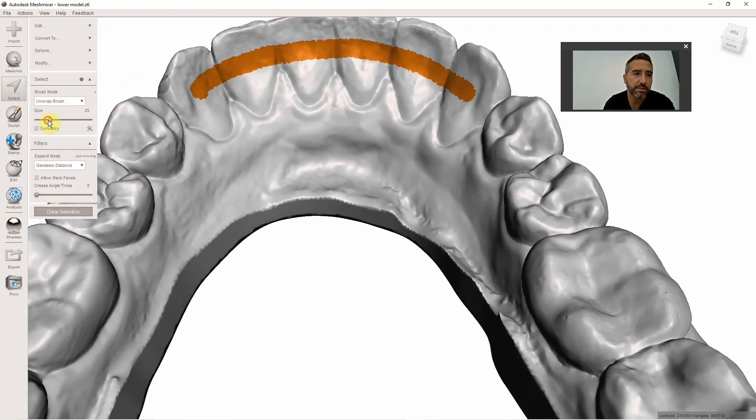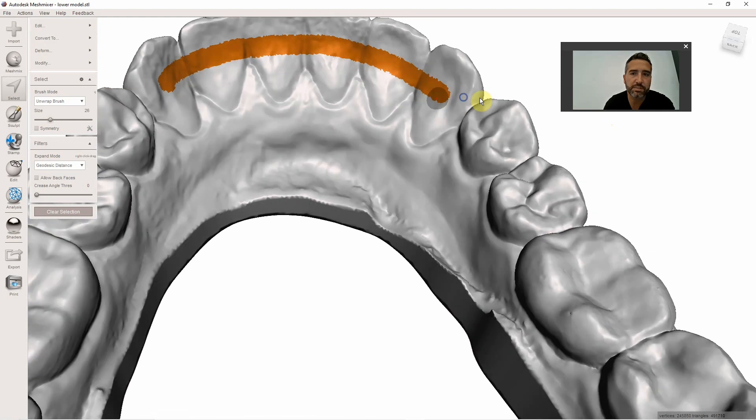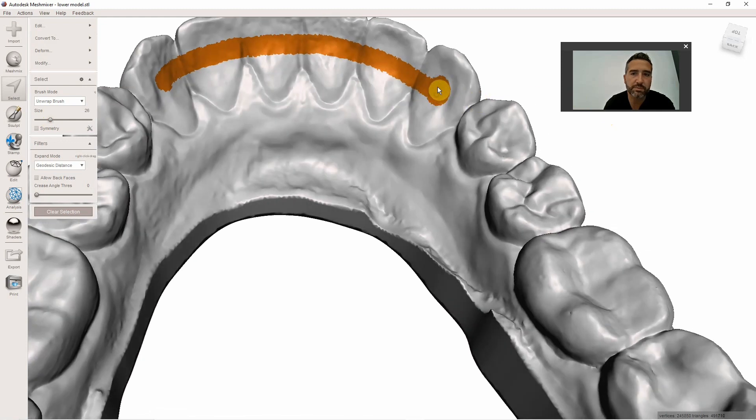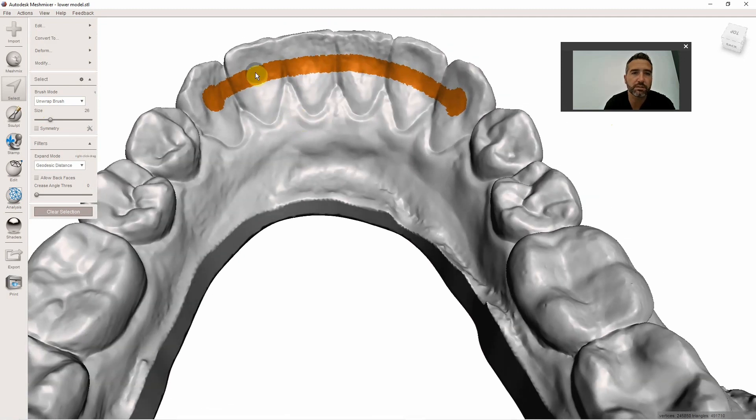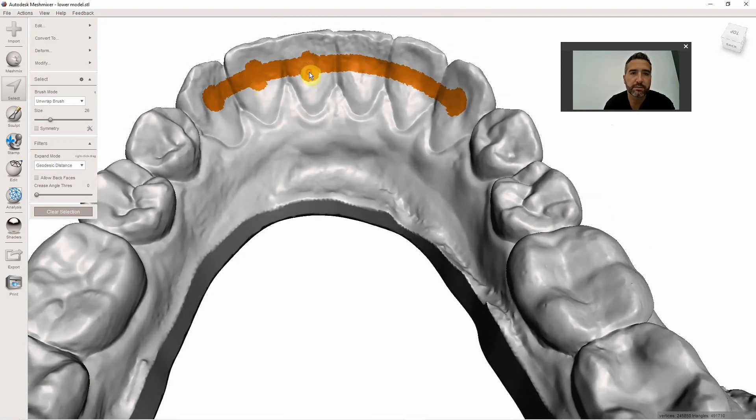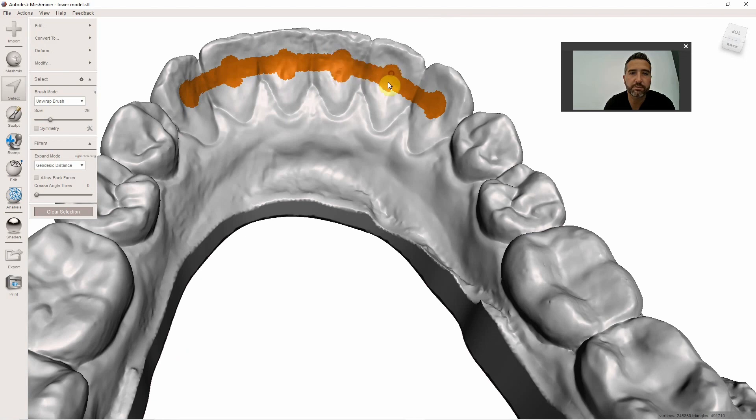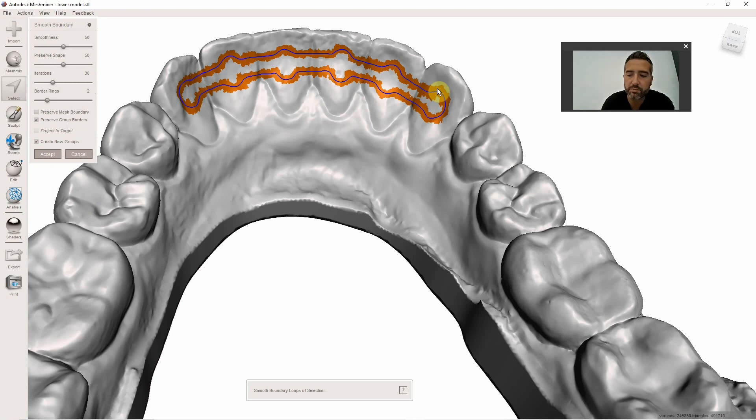What I'm also going to do is create some retention elements here on the cuspids, a little bit right there, a little bit right there. I sometimes will create little retention elements like so. Hit B on the keyboard, B as in boy, to smooth that.